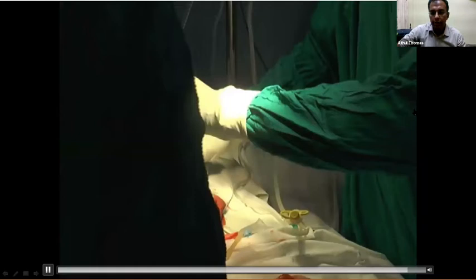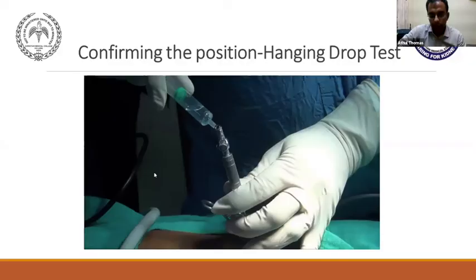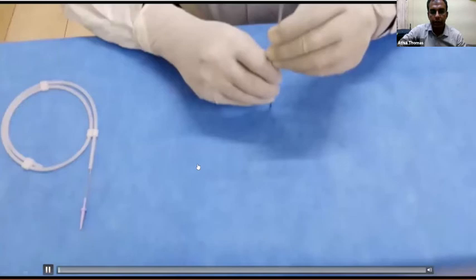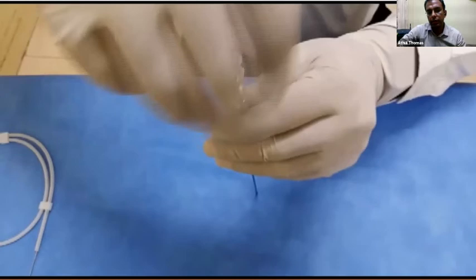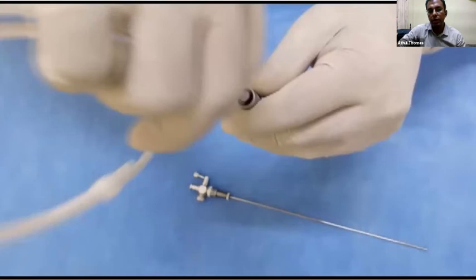The hanging drop test: before the catheter goes in, a drop of fluid is placed on the Veress needle. Once it is inside the peritoneal cavity and the stopcock is in line with the needle, the fluid is drawn inside — indirect evidence of intraperitoneal placement. Once filled with adequate fluid, the inner stylet is removed and the guide wire is inserted. This is the main difference between the reusable and single-use versions; we now prefer the reusable ones.